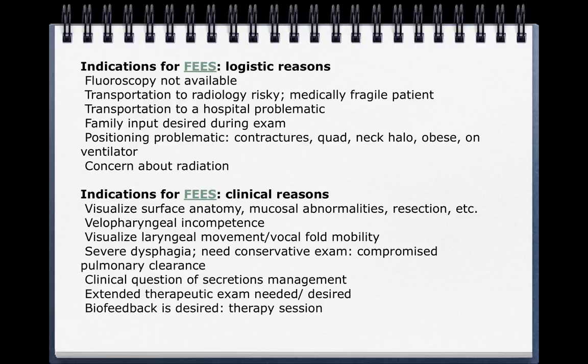So it can be a therapeutic aid simply because you are able to keep the endoscope in place as long as the patient can tolerate it. So it's a useful technique for that reason.